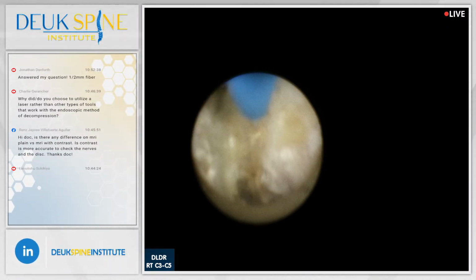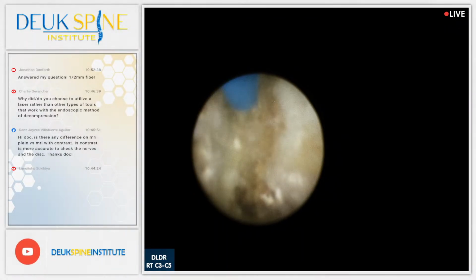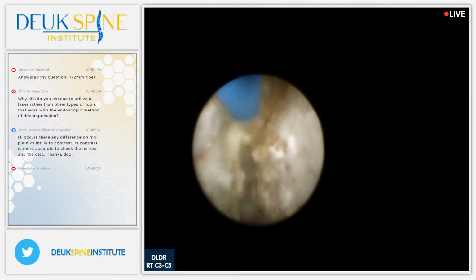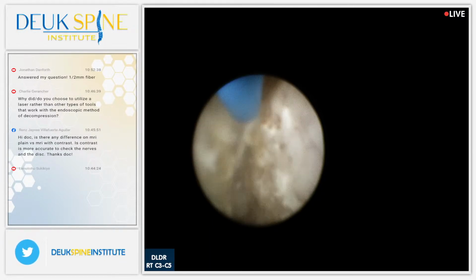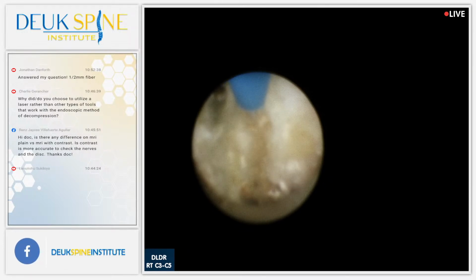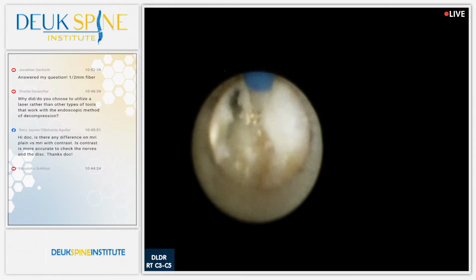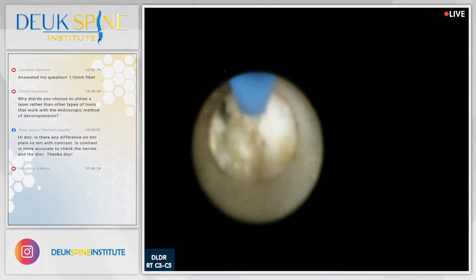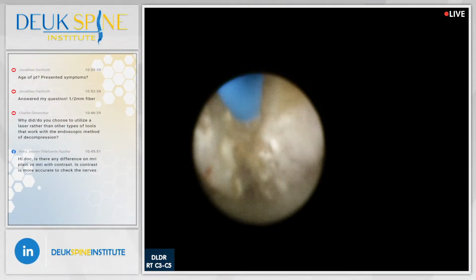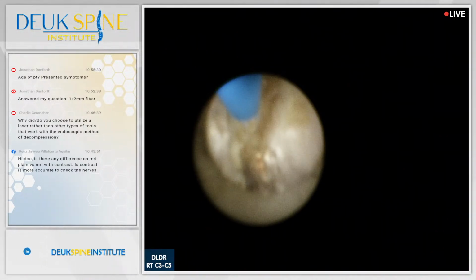Any other questions? No current questions, but we do have a comment from Jonathan on YouTube who said that you did answer his question, and the answer was 0.5 millimeter fiber. Yeah, the glass fiber is 0.5 millimeter. There's nothing in medicine that's that fine that can be put down an endoscope. This is the finest, smallest, most accurate tool. And by the way, the accuracy in my hands with this fiber and endoscope is 0.5.